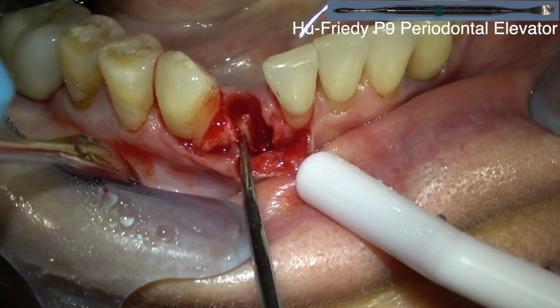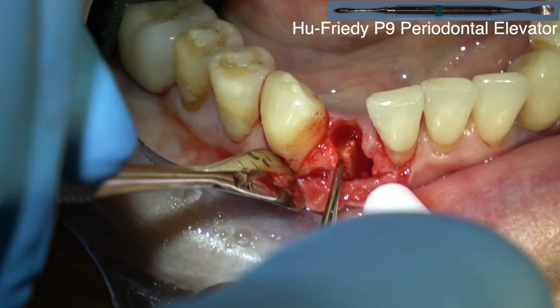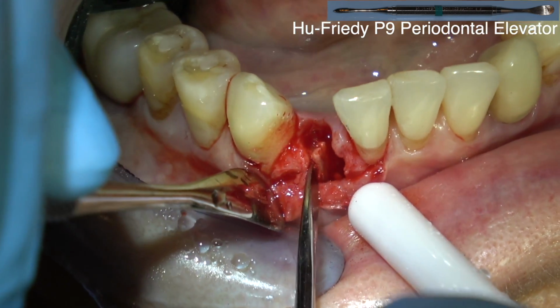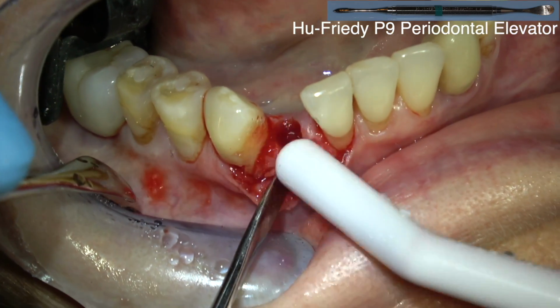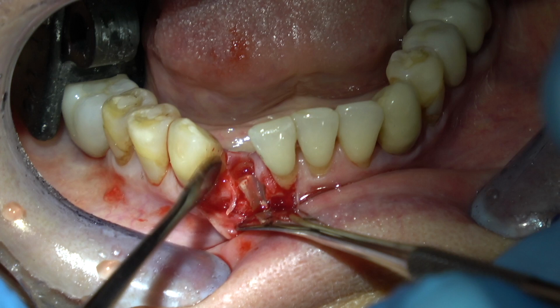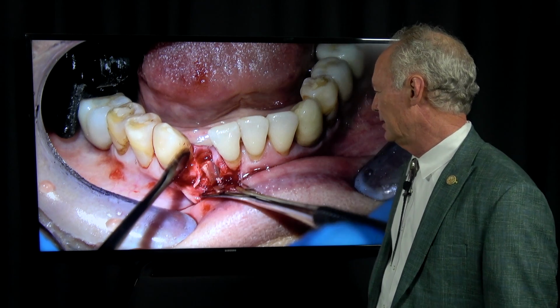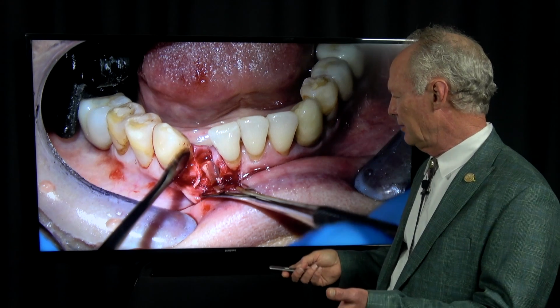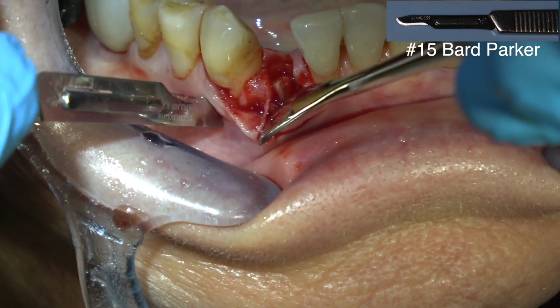Now what if I couldn't get this piece out? Sometimes you've got to take a round burr and just drill the remaining part of the tooth out if you're placing an implant. Now if I wasn't placing an implant, especially if it was in the posterior part of the mouth, I might just sleep the root. I would take most of it out and I might leave the apical 1/3 of the root in place. But in this case, if I'm placing an implant, I really need to extract the entire root. You can see this remaining part.